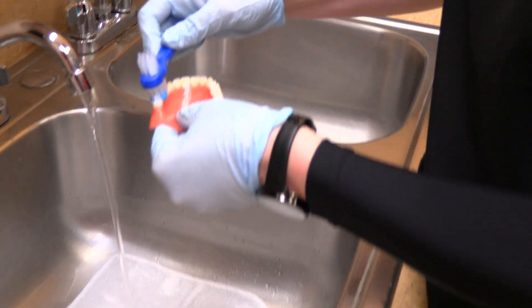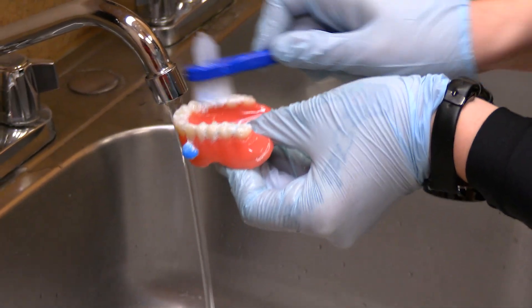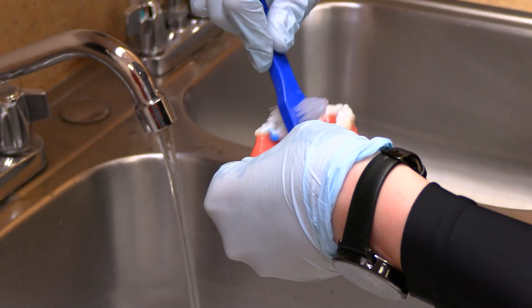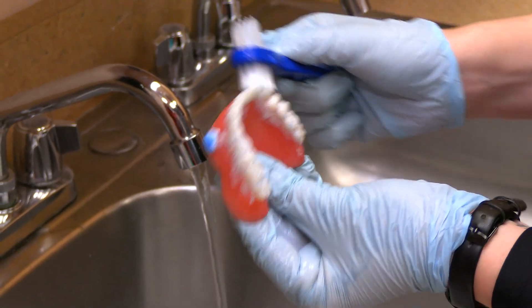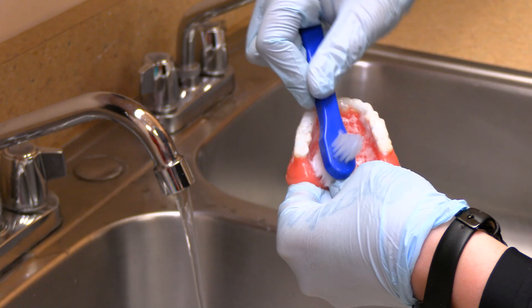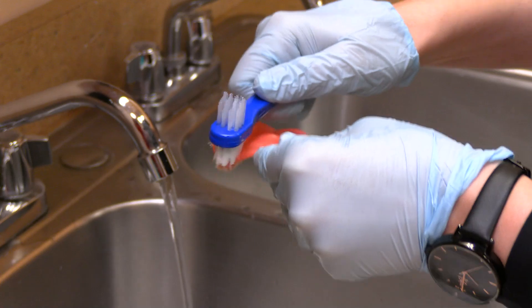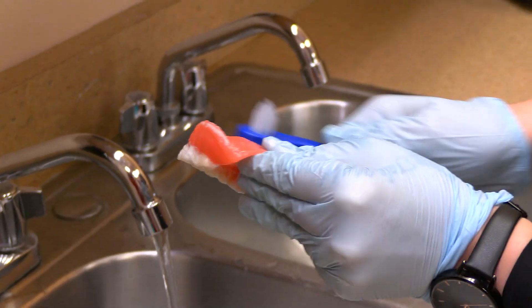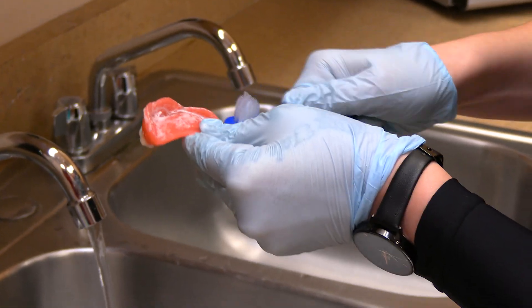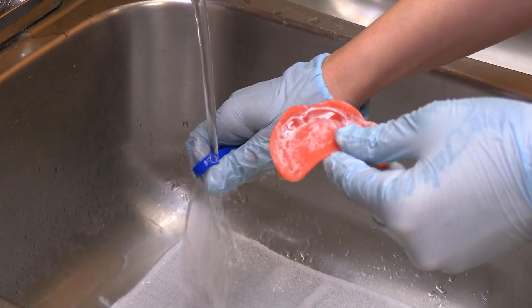I'm going to start by cleaning the chewing surfaces of my dentures. I'm then going to clean the inners of the dentures and the outers, as well as the plate and the groove. I'm going to rinse my denture brush and make sure that all the denture paste is out of it without flicking water.